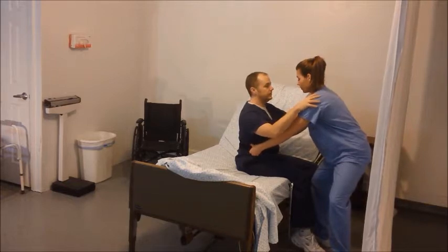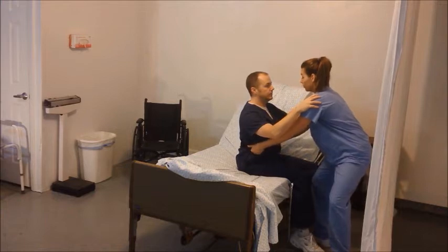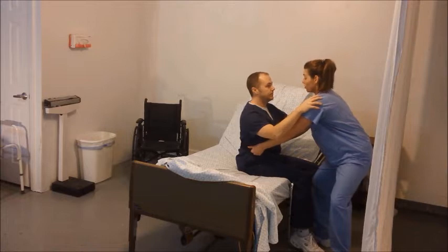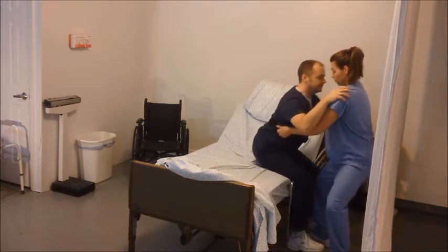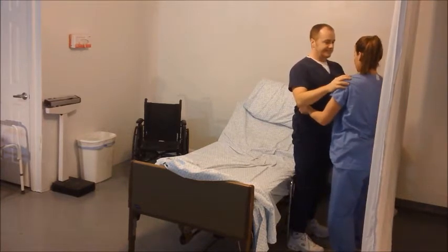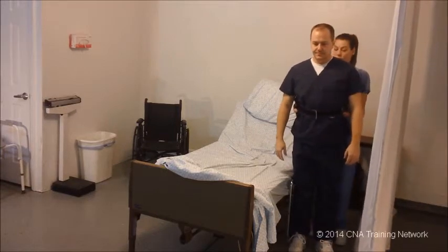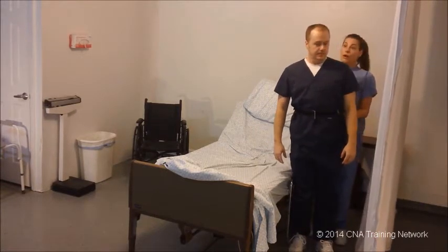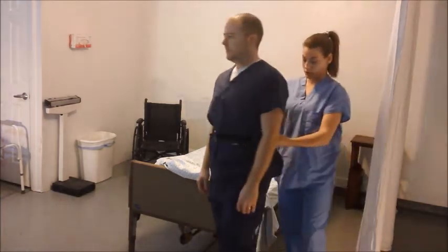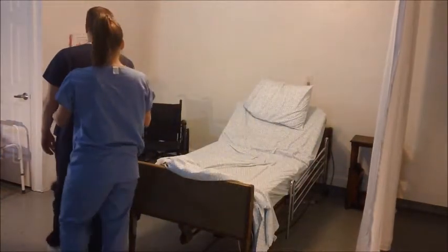On signal, gradually assist client to stand by grasping transfer belt on both sides with an upward grasp. Candidate's hands are in upward position and maintaining stability of client's legs. Ask client how they feel upon standing. Walk slightly behind and to one side of client for a distance of 10 feet while holding onto the belt.